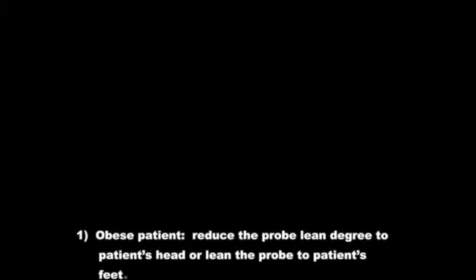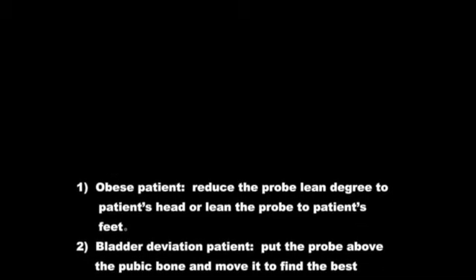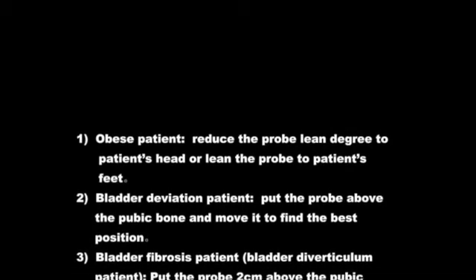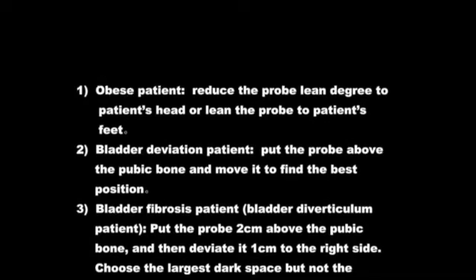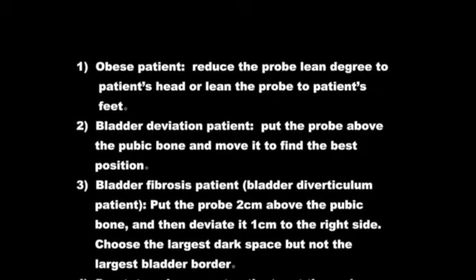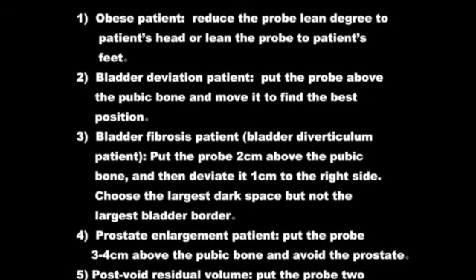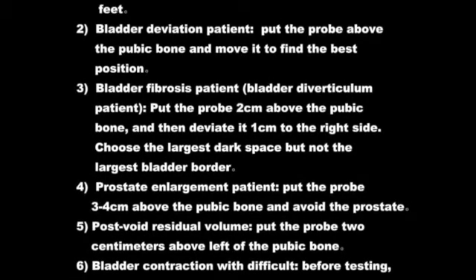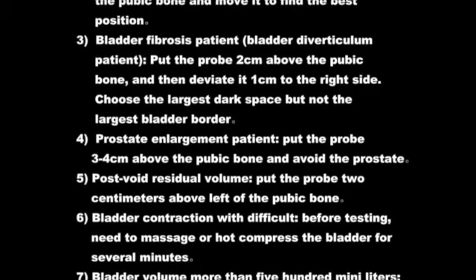For obese patients, reduce the probe lean angle to the patient's head or lean the probe to the patient's feet. For bladder deviation patients, put the probe above the pubic bone and move it to find the best position. Bladder fibrosis patient, that is bladder diverticulum patient, put the probe 2 centimeters above the pubic bone and then deviate it 1 centimetre to the right side. Choose the largest dark space, but not the largest bladder border.